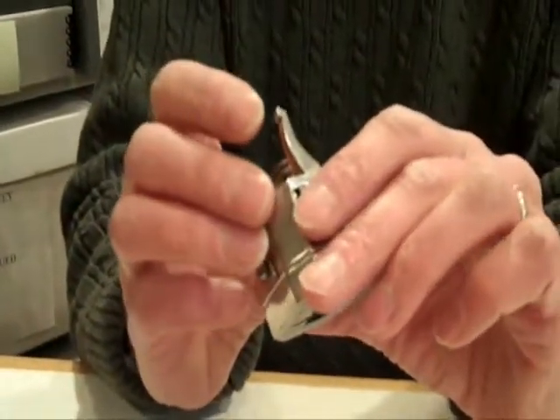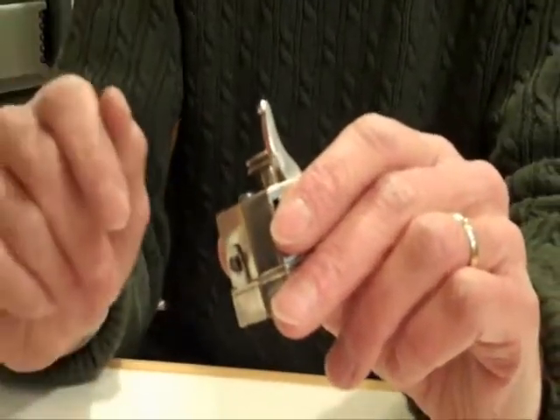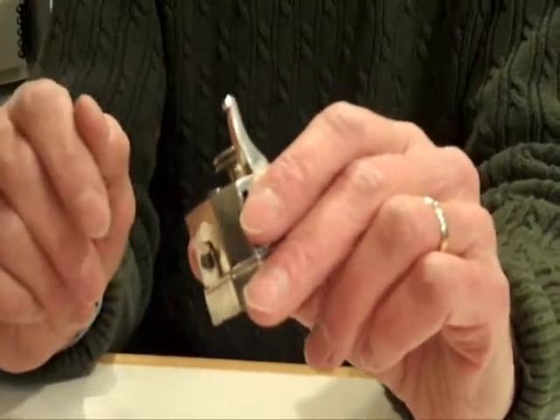A scarificator would be used, of course, when you wanted to draw a lot of blood, as opposed to a single blade lancet or a spring action lancet.